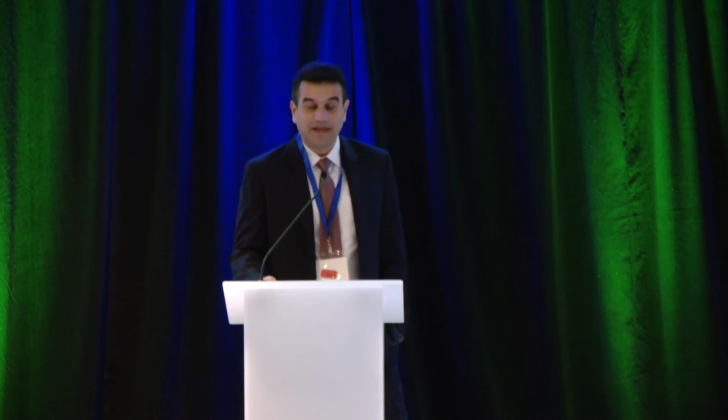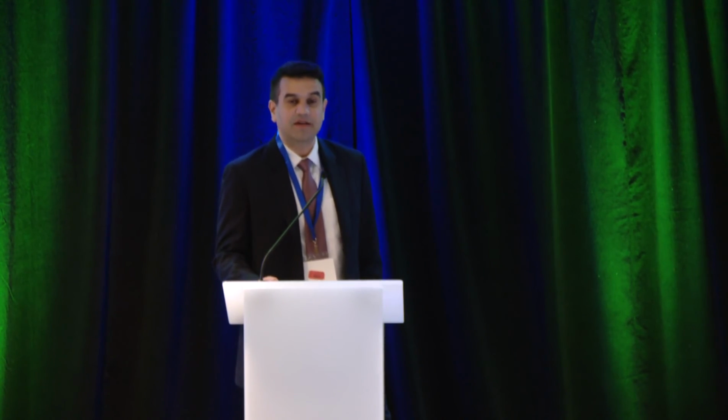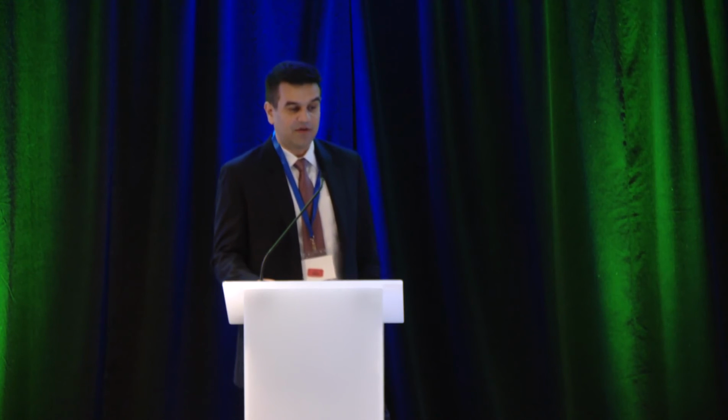Now, the last disorder we're actually going to make is ineffective motility. Now, those of you who remember 3.0, it was a little easier to make this diagnosis on high-resolution manometry, because now to really make a conclusive diagnosis of IEM, you need greater than, not at least, 70% ineffective, meaning at least 80%, really, typically if you're doing 10 swallows, weak or failed by DCI or a greater than 5 centimeter break, or you need at least 50% failed with that DCI under 100.